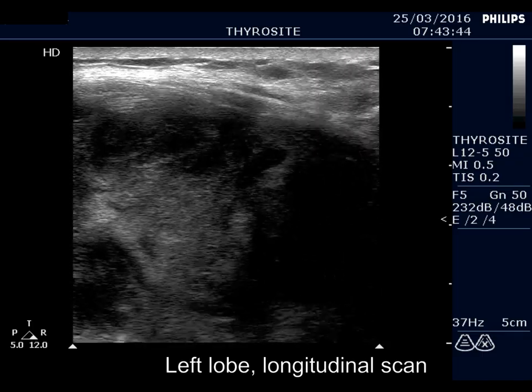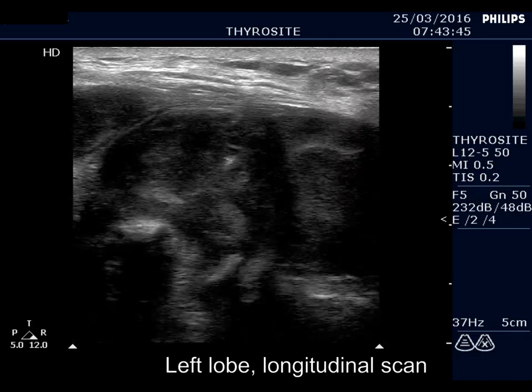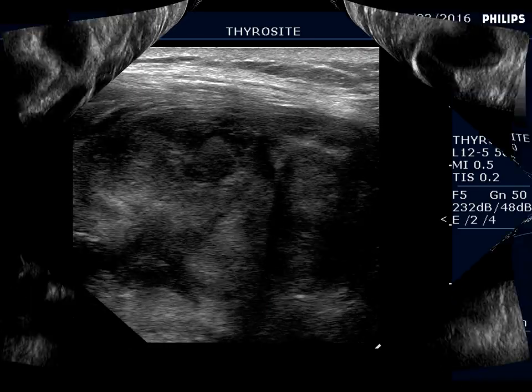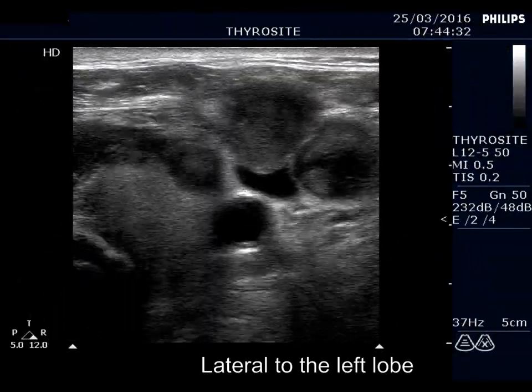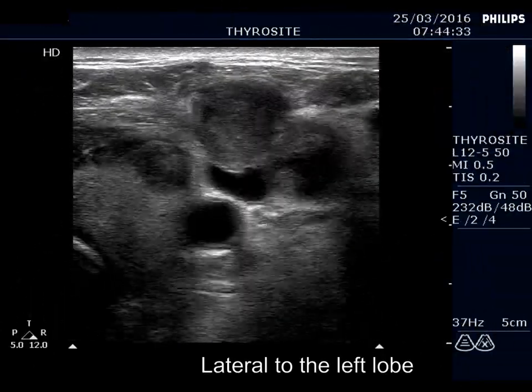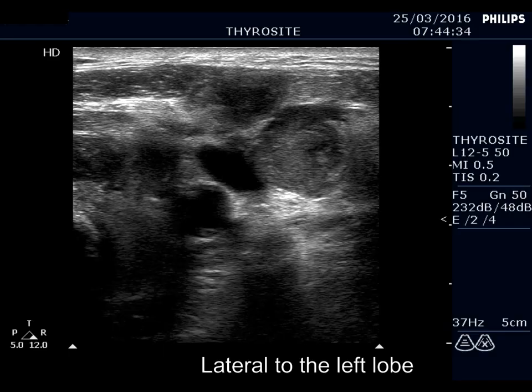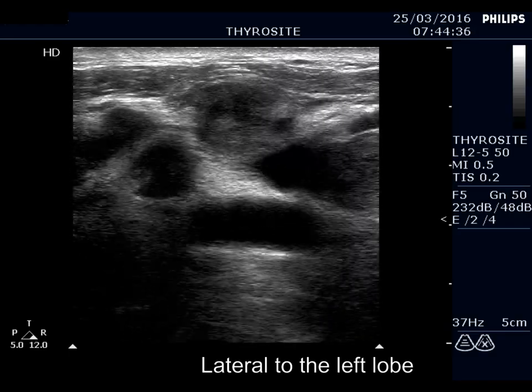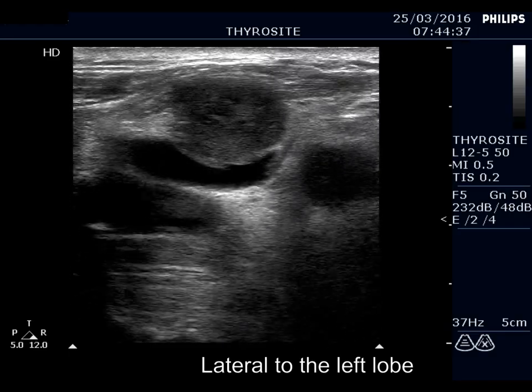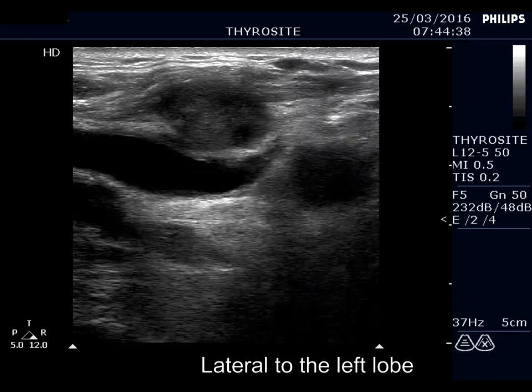The borders of the tumor are irregular. There are multiple lymph nodes upper and lateral to the left thyroid lobe. The nodes have a heterogeneous pattern and lack a hilum.